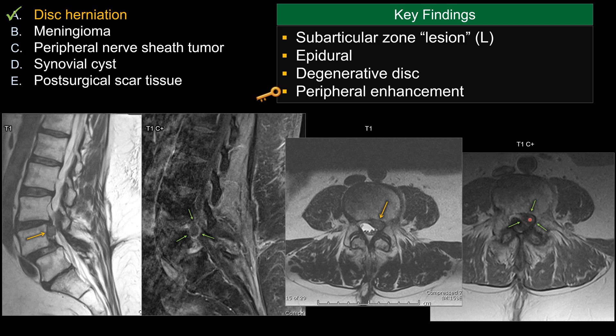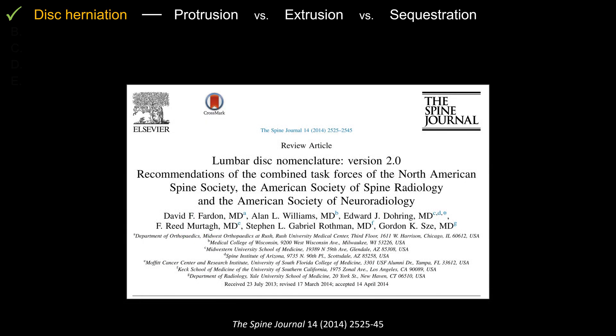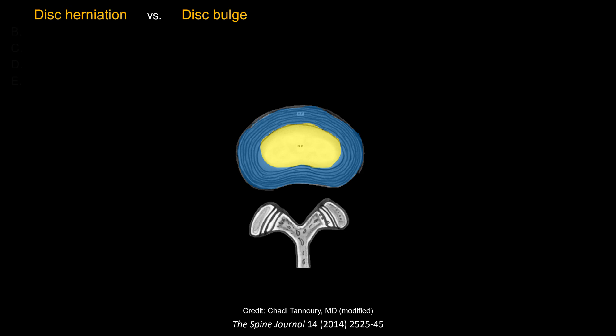Notice that there's very little central enhancement. That distinguishes it from others such as meningioma or schwannoma. For disc herniation, you want to characterize them into disc protrusion versus extrusion versus sequestration. It's a good idea to keep the language consistent. This is a review article with the nomenclature we are using — you can find that in Radiopaedia or other sites such as radiologyassistant.nl.